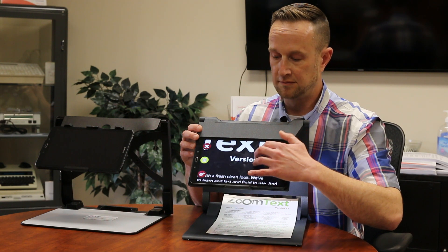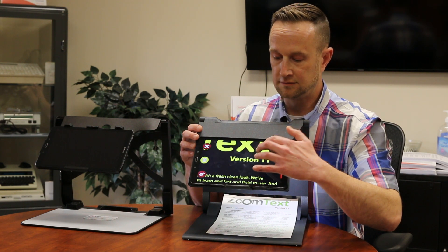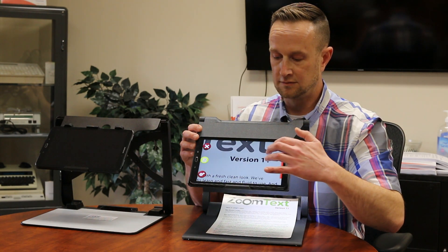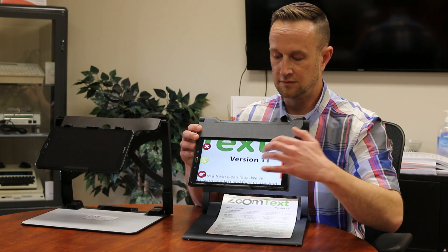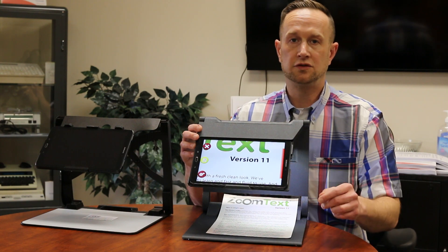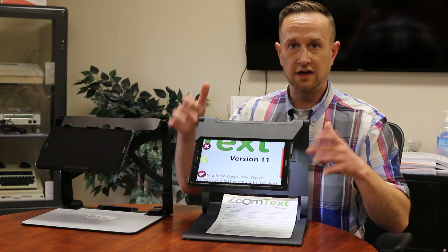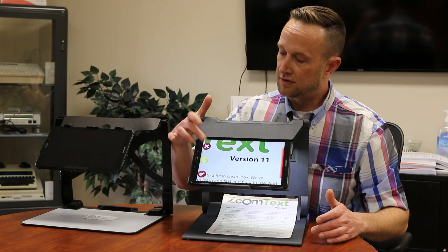Color contrast options include red on black, black on yellow, yellow on black, black on green, green on black, blue on yellow, yellow on blue, gray, original, and high contrast. It even has two true colors: original and high contrast true colors. So you've got a nice video magnifier here, and at any point you can exit out of it.